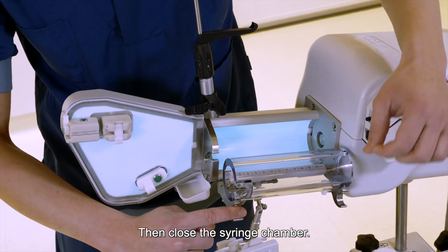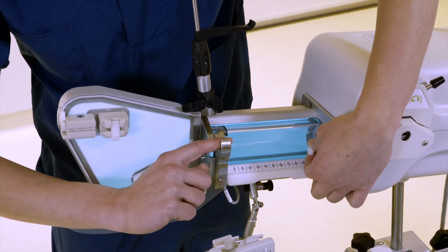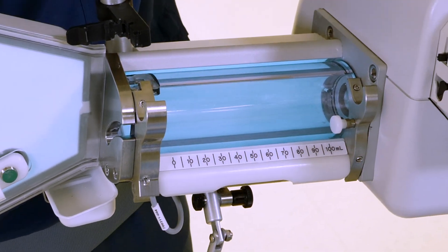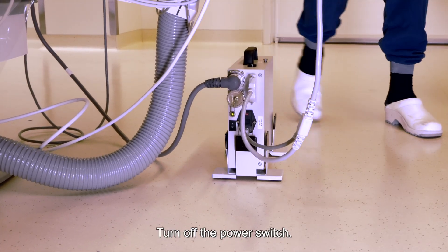Then close the syringe chamber. Step 4: turn off the power switch.